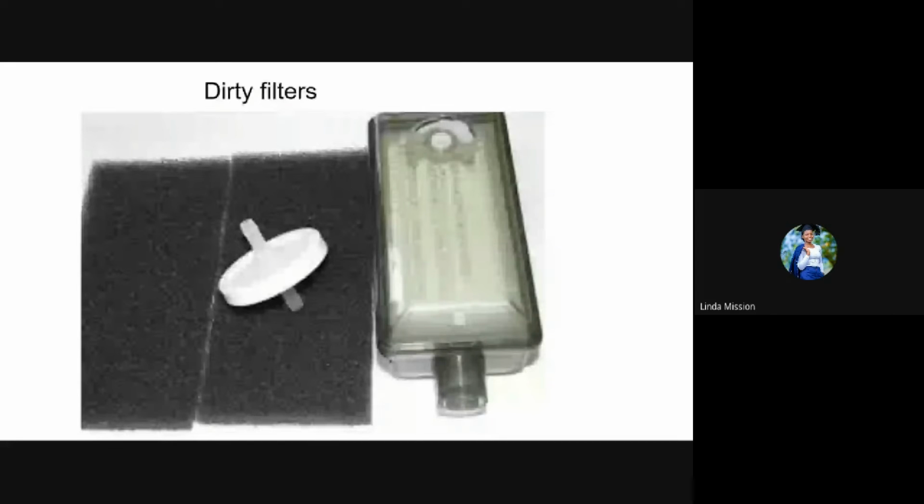Another cause for increase in noise levels in oxygen concentrators is loose screws and internal components of the concentrator. There are times when screws are not tightened all the way after the concentrator has been serviced. The vibration produced by the concentrators can cause these screws to get loose, and this in turn causes an increase in the noise level since the components can be hitting each other and also hitting the casing of the concentrator.